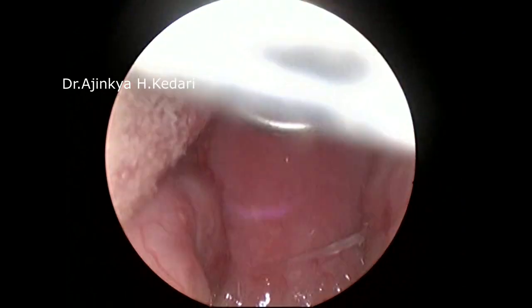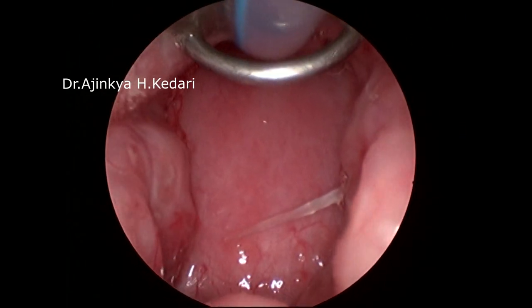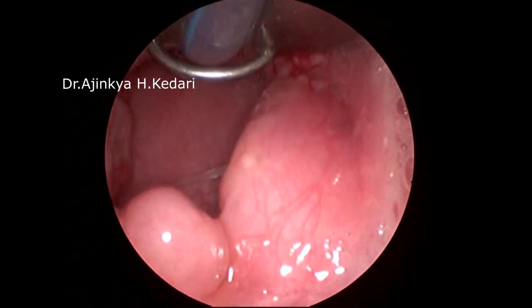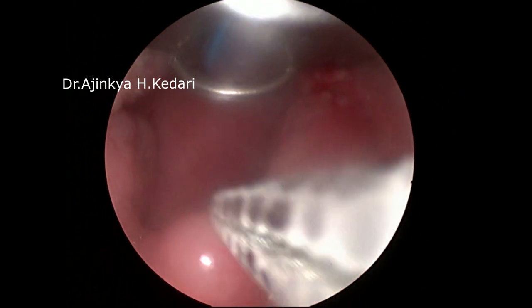As you can see, that is the segment of the fish bone lodged within the right tonsil. From my experience, I can say that another half of the segment is within the tonsil.